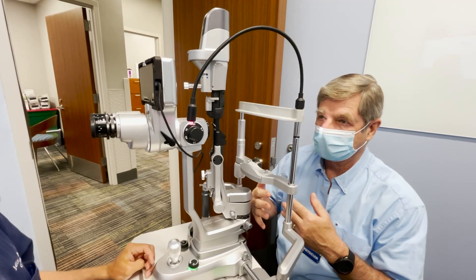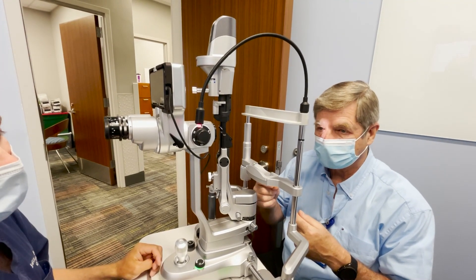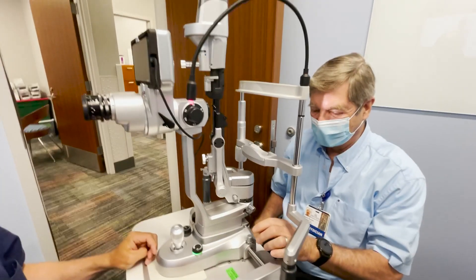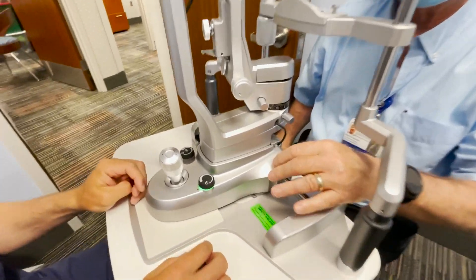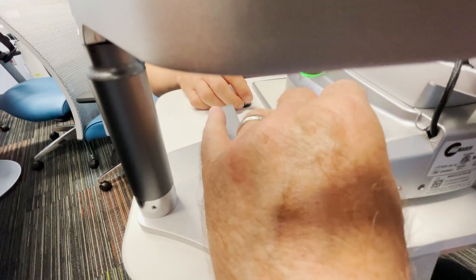At higher magnification, the depth of field is much less, and you can see yourself shaking. This knob here locks the slit lamp down so it won't move — when you finish, lock it back up so it won't roll around.